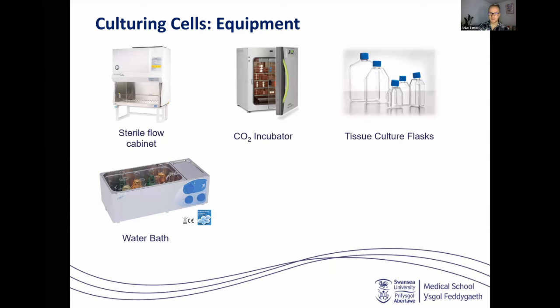You might need a water bath. So loads of people warm up their media. We normally keep media in the fridge, so that's about 4 degrees. If your cells are at 37 degrees, you don't want to be putting really cold liquid on them. So what we do is we warm everything up for them. So essentially, nice warm media. They're all nice and happy, nice and cozy, and they continue to grow and divide.